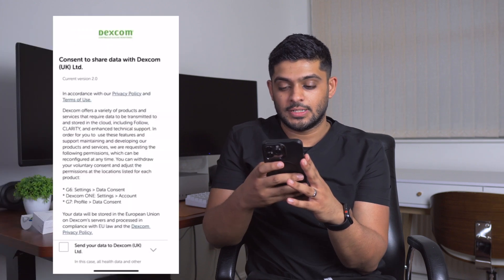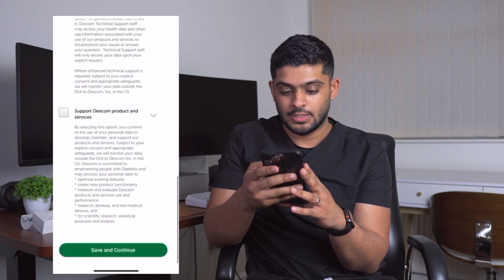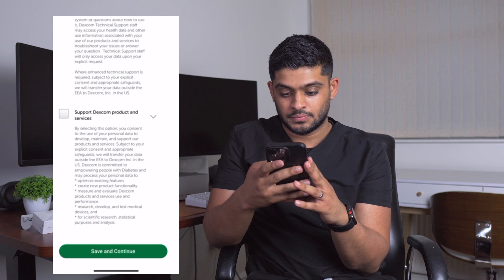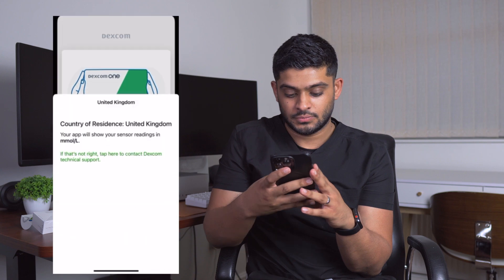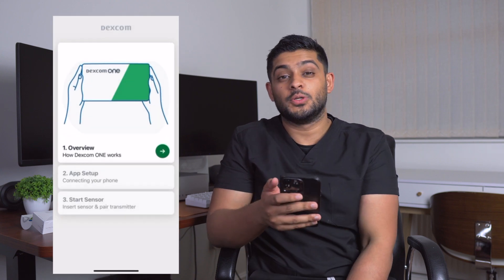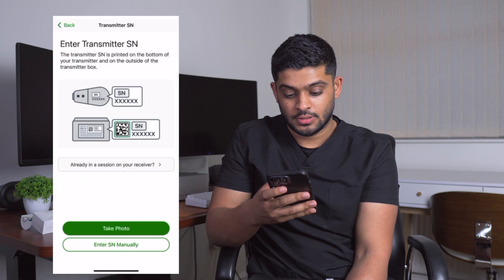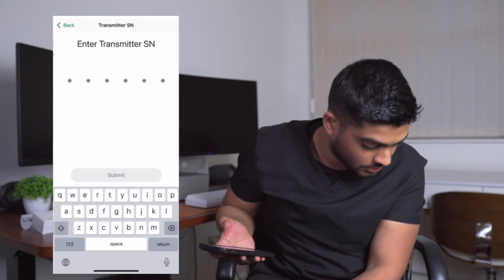Now I'm going to go on the Dexcom app and set it up for the first time. I've got the transmitter and sensor in place. I'm going to agree to the legal side of things, allow Bluetooth for the Dexcom to connect, allow notifications, and put in the serial number of the transmitter.